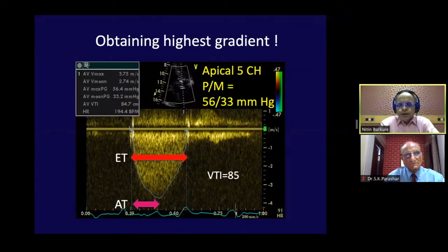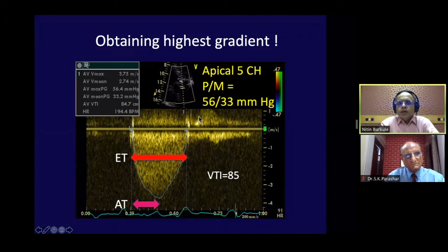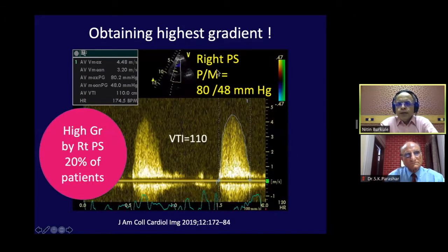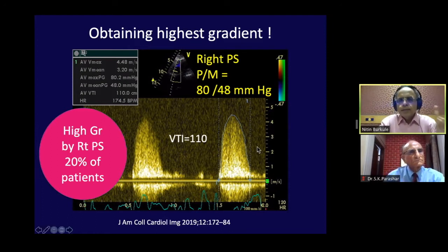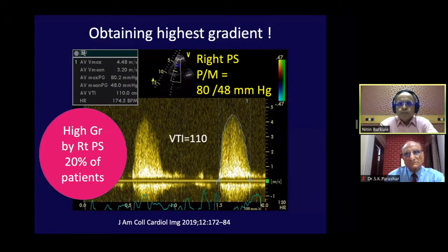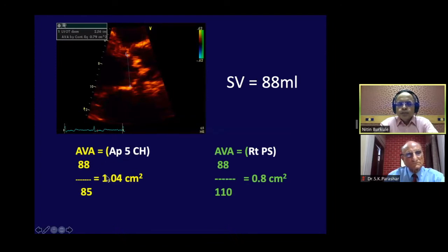Once you get the CW envelope across the aortic valve, measure the ejection time (ET), acceleration time (AT), and the AT/ET ratio. For example, from a five-chamber view we may get a peak systolic gradient of 56 and mean of 33, but from the right parasternal view the gradient jumps to 80/48. Remember, 20 percent of patients get a higher gradient through the right parasternal window. Explore all possible windows — five-chamber, right parasternal, subcostal, and suprasternal — to get the maximum gradient. The same patient could have valve area of 1.0 from five-chamber view versus 0.8 from right parasternal.